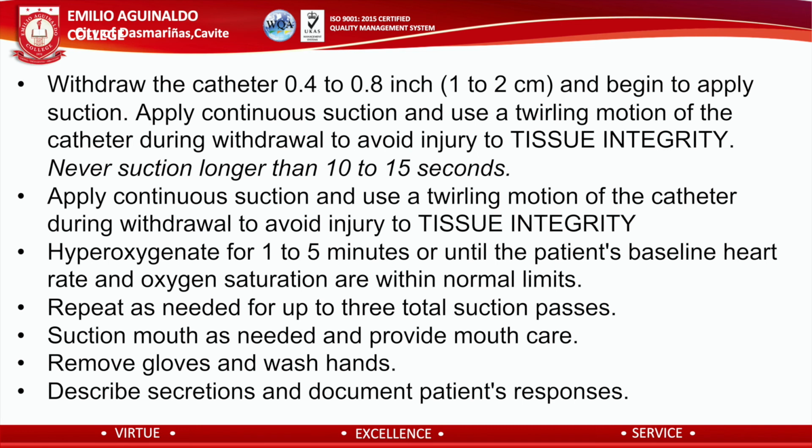Hyperoxygenate for 1 to 5 minutes or until the patient's baseline heart rate and oxygen saturation are within normal limits. Repeat as needed for up to 3 total suction passes. Suction mouth as needed and provide mouth care. Remove gloves and wash hands. Describe secretions and document patient's responses.